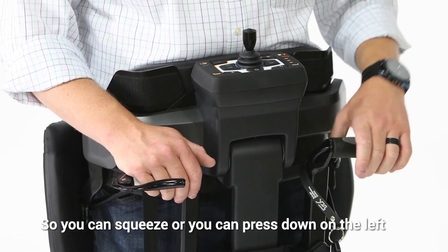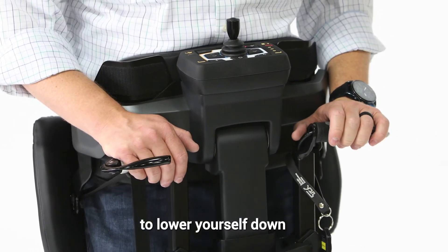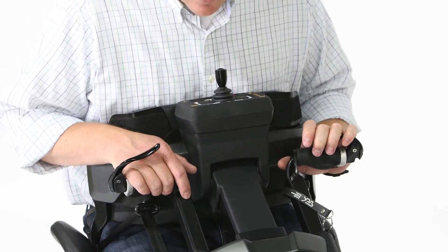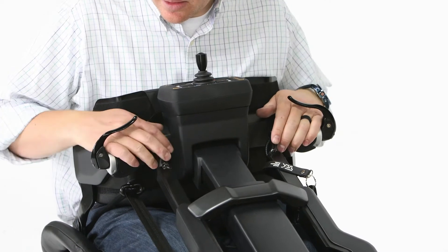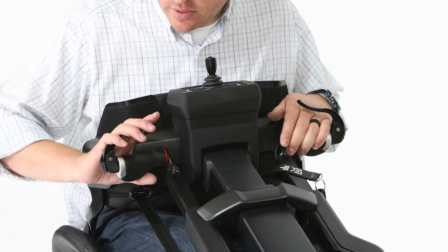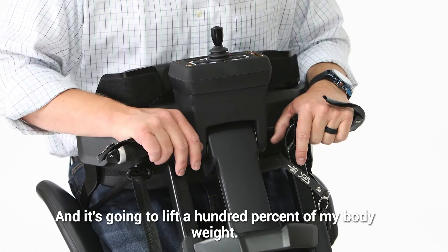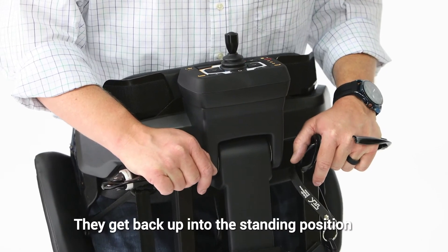You can squeeze or press down on the left lever to lower yourself down. Then on the other side to raise myself back up again, I can squeeze it or just put some weight on it and push it down — it's going to lift 100% of my body weight to get back up into the standing position.